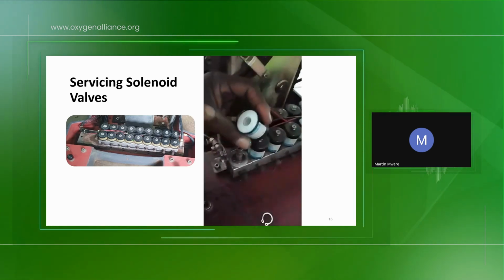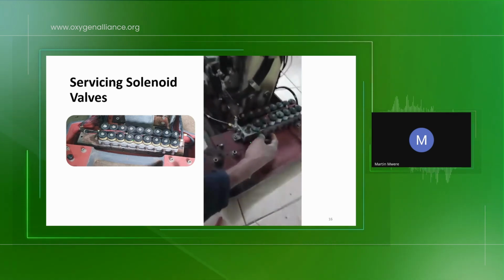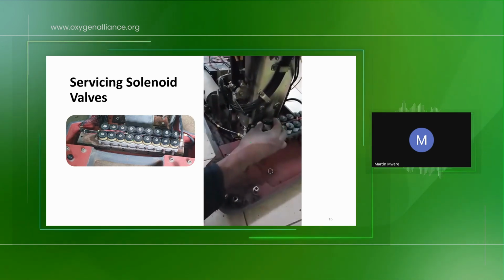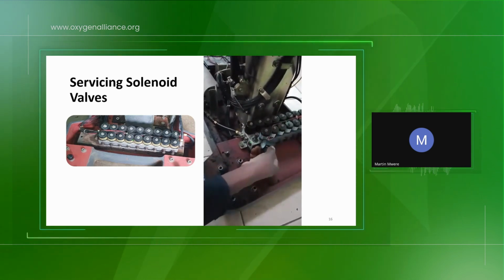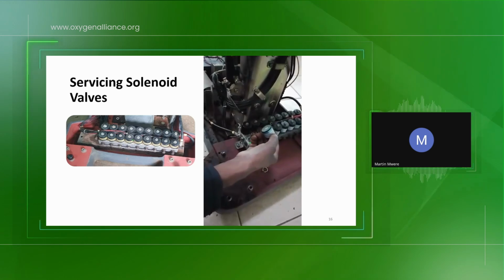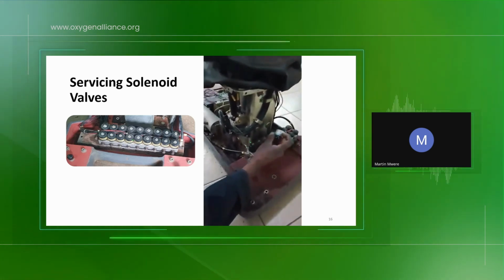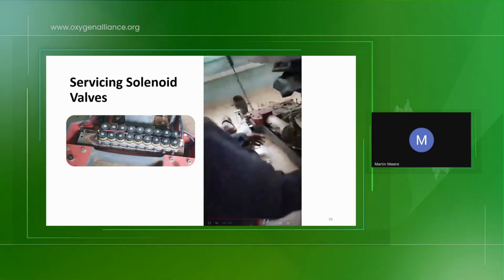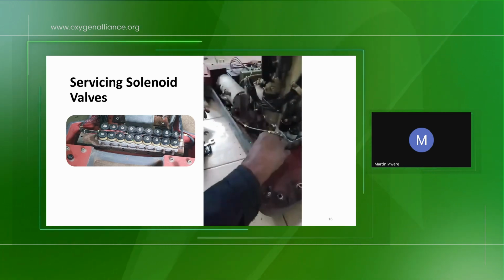After you clean the shaft, you also clean the body inside. You get emery paper, number 0 or 01, and you run it through the body. Then after cleaning with the emery paper, you get gauze and run it through the solenoid valve, and you also wipe clean this shaft. At that time, you use the gauze plus electronic contact cleaner to clean the inside of the solenoid valve. But one safety requirement here: you should never leave that solenoid valve powered.